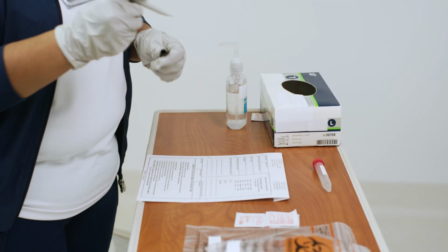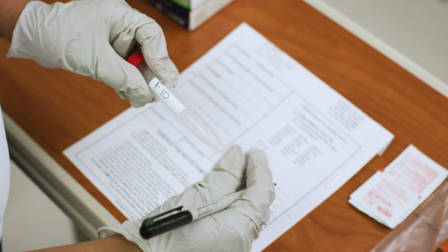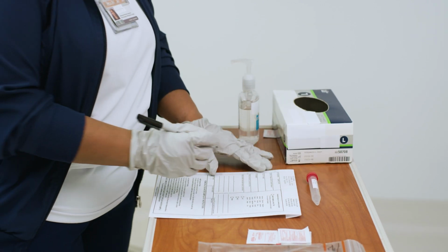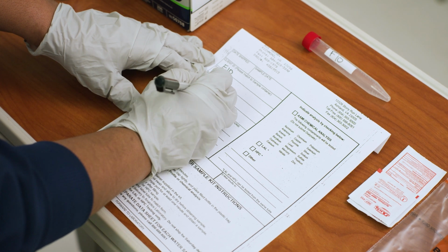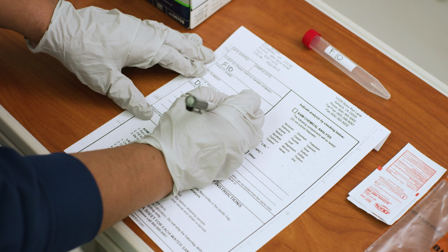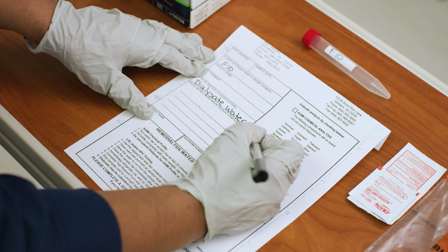With a permanent marker, label the sterile test tube with the name of the machine you'll be testing. Fill out the log sheet. Be sure to check the appropriate boxes to indicate which tests will be performed. In this case, we'll be testing the dialysate fluid for microbials and endotoxins and should check the boxes LAL and HPC.